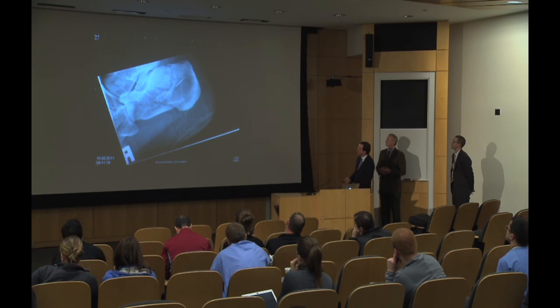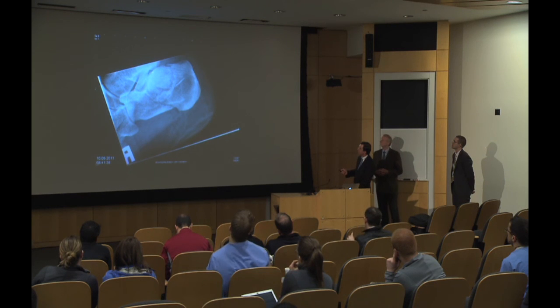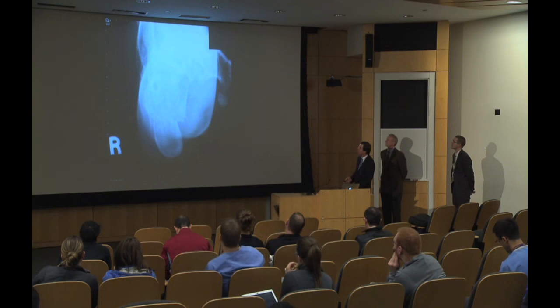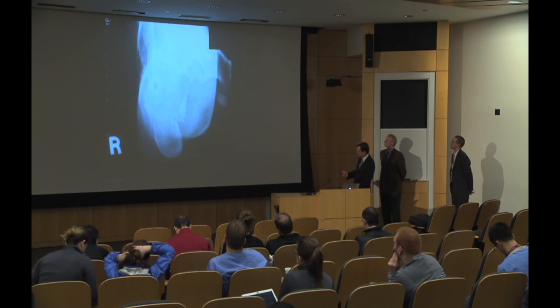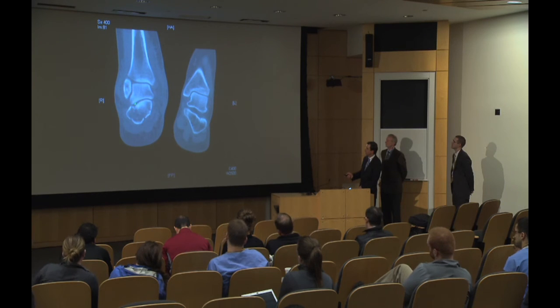This is another view that shows the most significant impaction is really at the tuberosity posterior facet interval and not so much in the front. You see this area is relatively spared. The medial wall is shifted, as you characteristically see, with a bulge here related to the posterior facet being depressed. This is just a CT scan. It shows you that really it's the entire posterior facet that articulates with the talus. There is a blowout of the lateral wall, but the major articular surface is essentially one fragment.